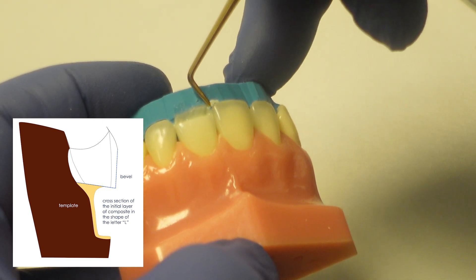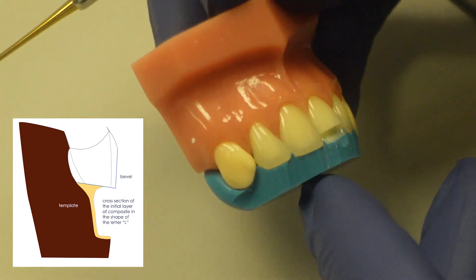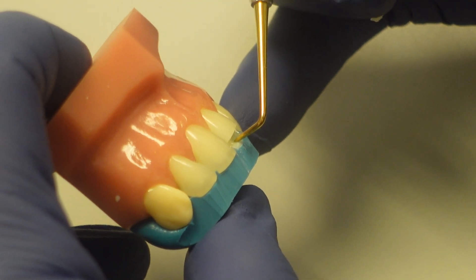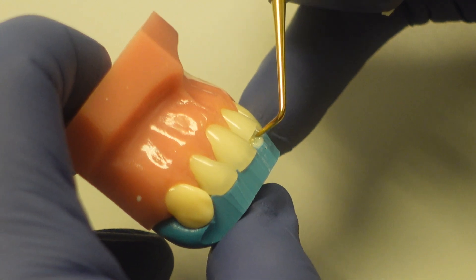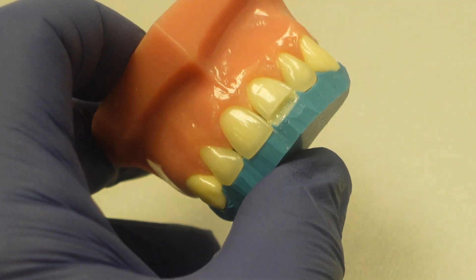This is one of the biggest issues when we do hands-on courses, which we love doing at Cosmonet Center for Aesthetic Excellence. The most common mistake is that people have a tendency to leave too much thickness of material here. And so there's not enough room for the other layers to create that really natural, beautiful incisal translucency.